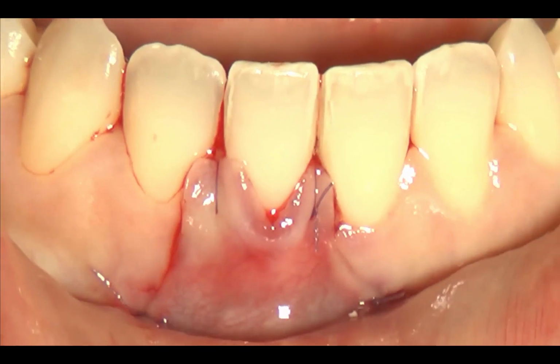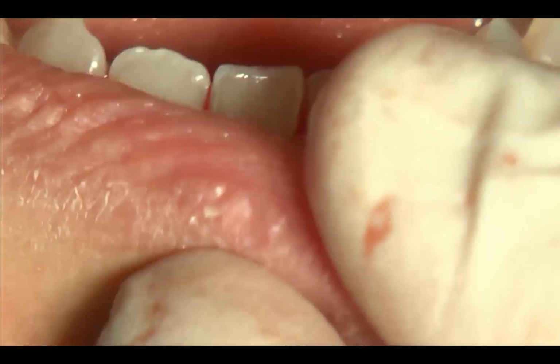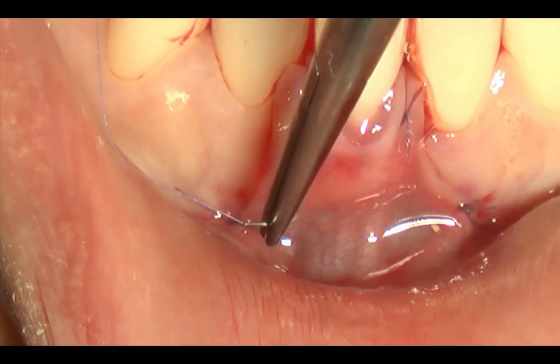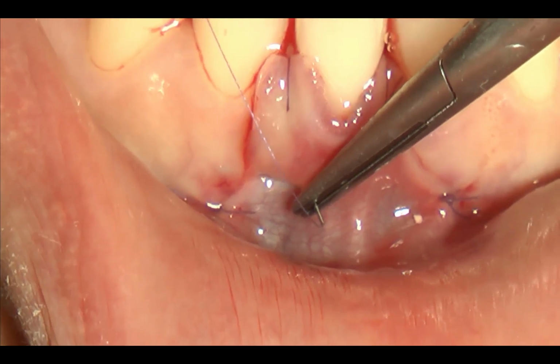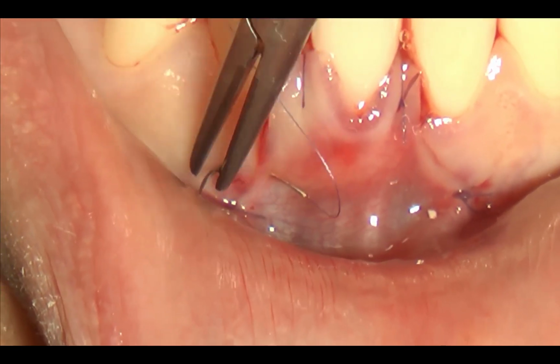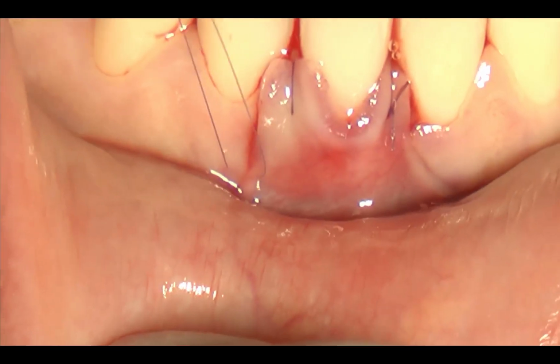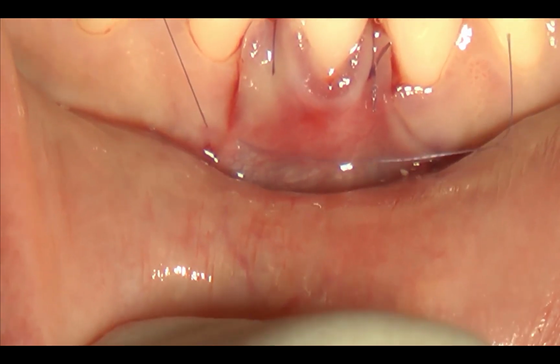Now it's very important to complete the suturing along the vertical release incision in every single micron of your flap, in this case with the interrupted suture, but by using the attached gingiva of the adjacent teeth.